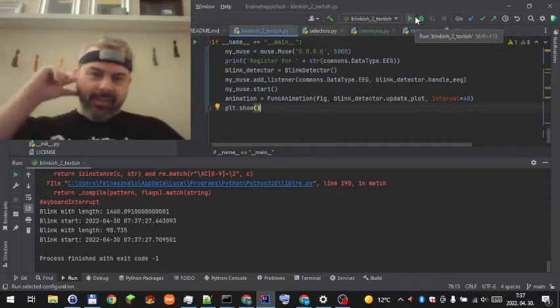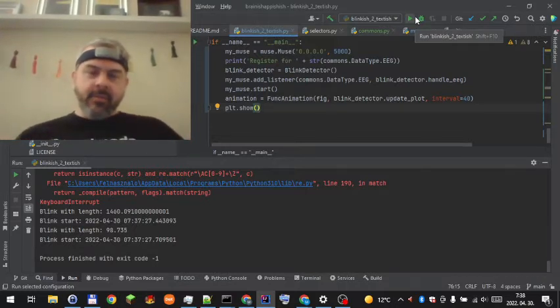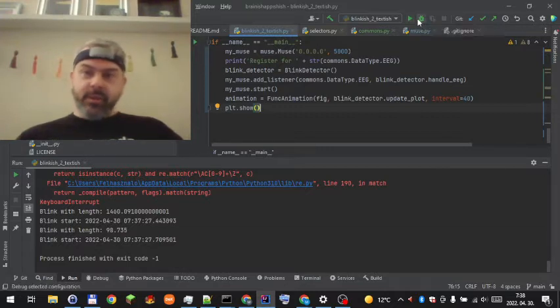I feel great. This is a huge milestone for me. This is the first time I can see my EEG signal on computer, which means I can see my brainwaves on my computer. I already saw it on my phone using the Mind Monitor app, but this time I see it using my first ever Python project, connecting to the Mind Monitor, getting data from it, and then using Python to display the result. Let's have a look.